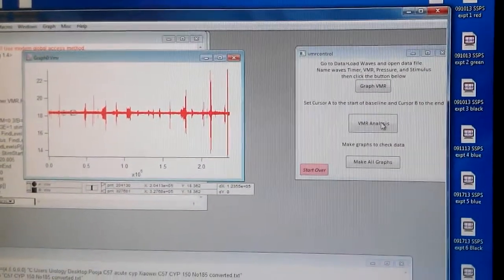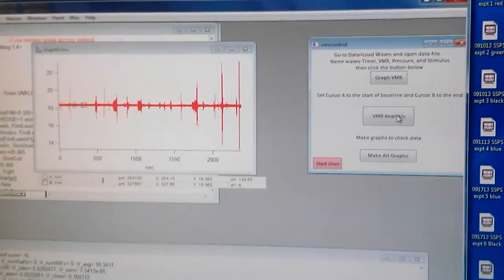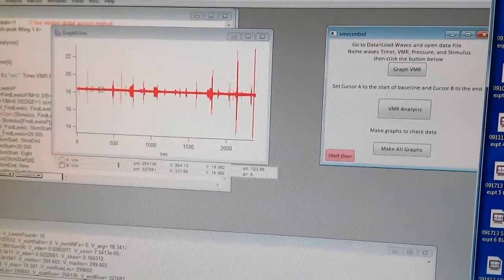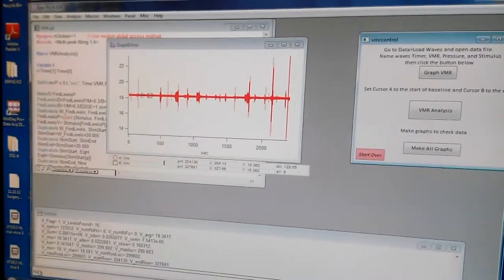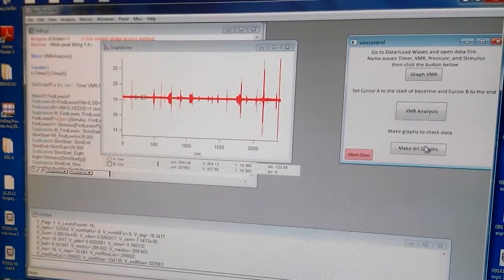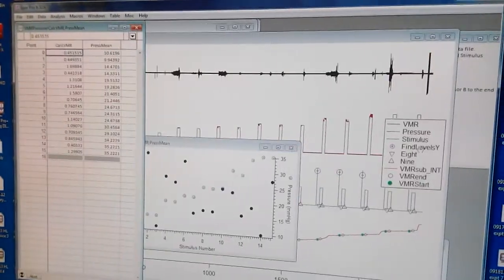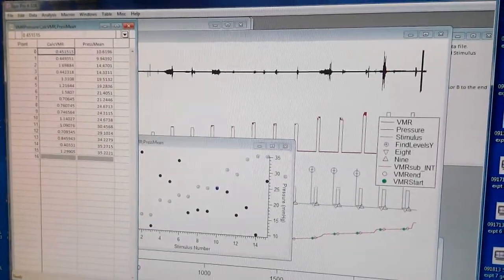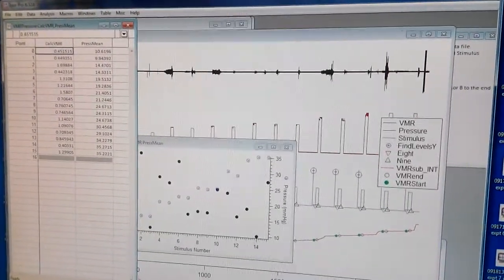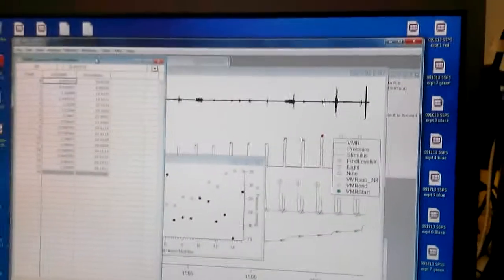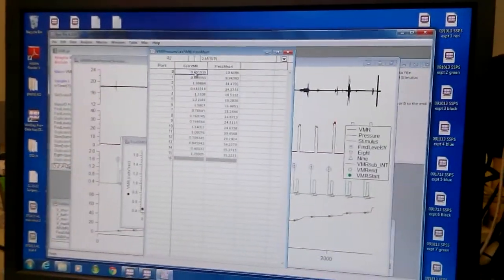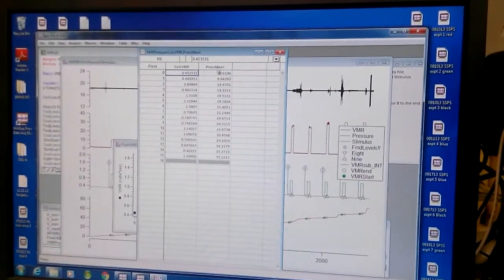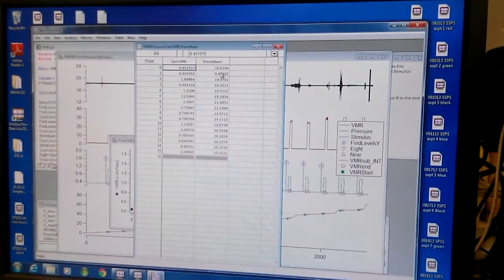You can watch out for this. Whenever it says ready, then you click make all graphs. So everything will come out. Mostly we are concerned with this data, where it says calculated VMR and press mean as in pressure.